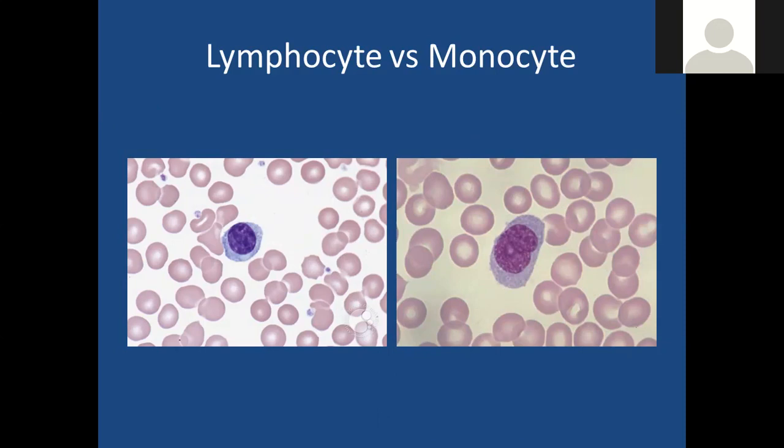Is it just in this example that there's more cytoplasm in the monocyte than the lymphocyte, or is that common? No, that's very common. And why is that? Because the lymphocyte has a high nucleus to cytoplasm ratio. The majority of your cell in a lymphocyte is going to be comprised of that nucleus. It is not uncommon for you to see a lymphocyte where you cannot see very much cytoplasm at all, just a very small perimeter around that nucleus. Very characteristic of a lymphocyte, that high nucleus to cytoplasm ratio, but again, very condensed clumping of the nucleus.